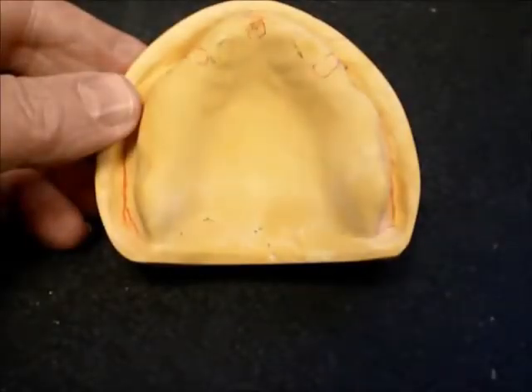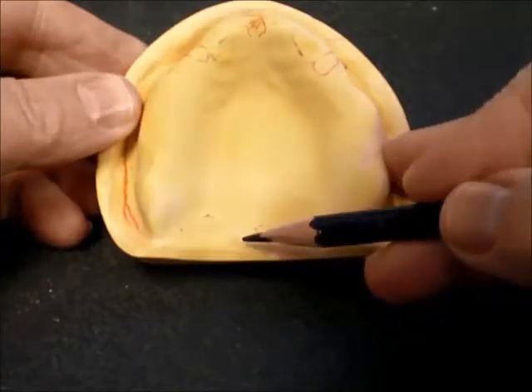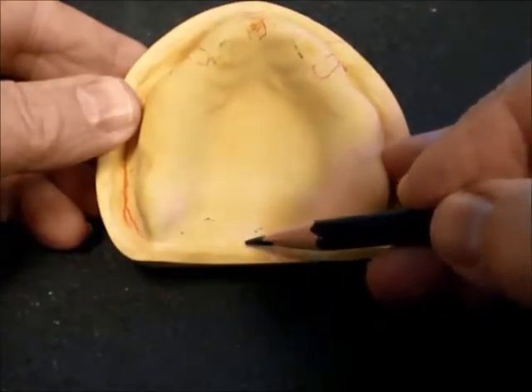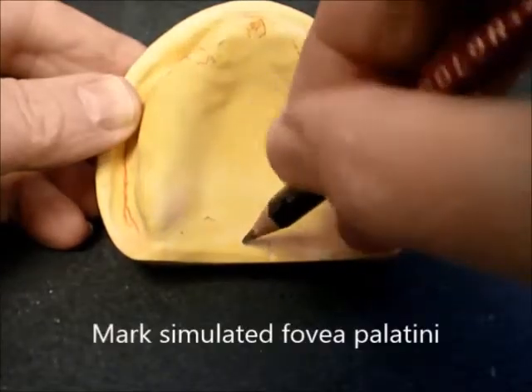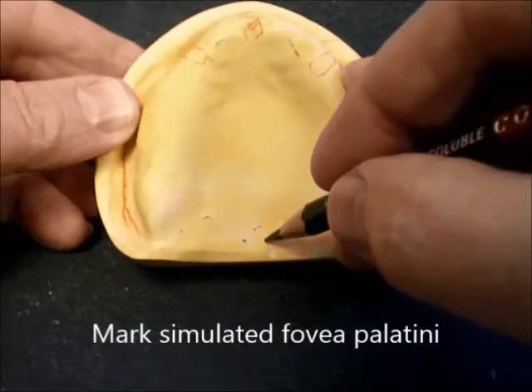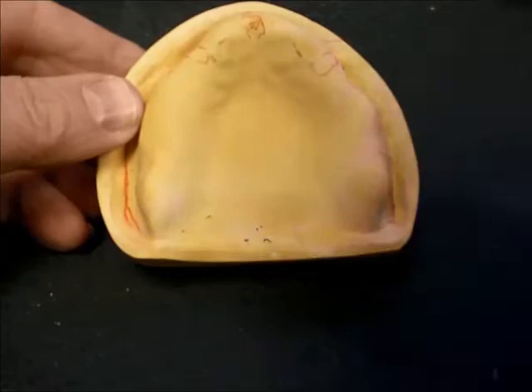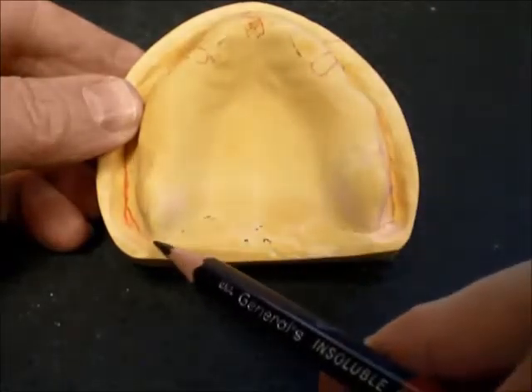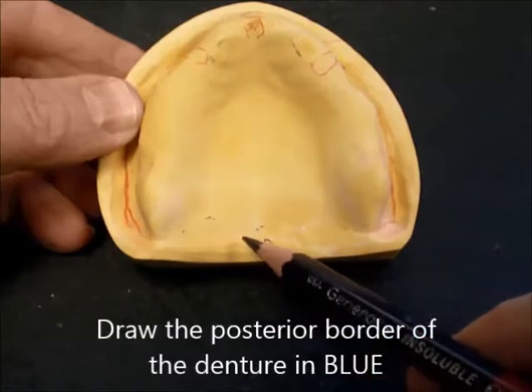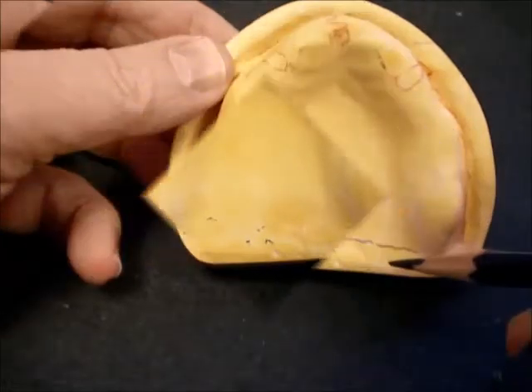This is a stone master cast, and we are going to mark the fovea palatini in blue pencil on the cast. We will draw the posterior border of the denture in blue. This posterior border represents the vibrating line, which runs from hamular notch to hamular notch, about 2 mm anterior to the fovea.